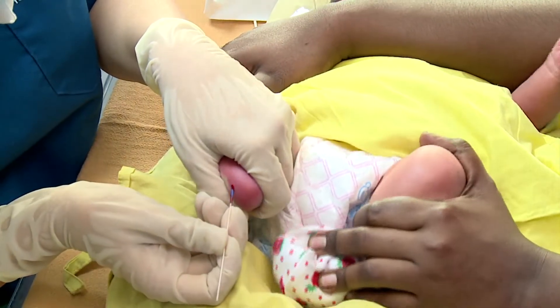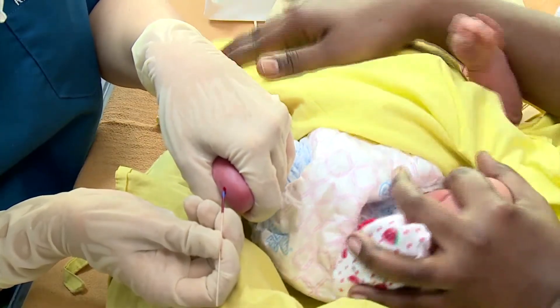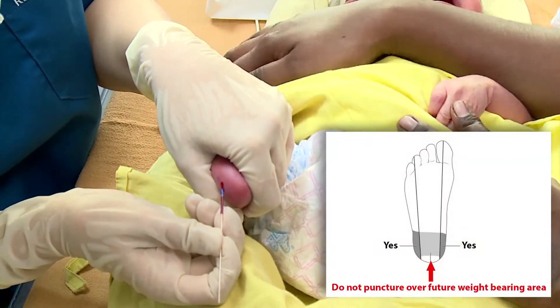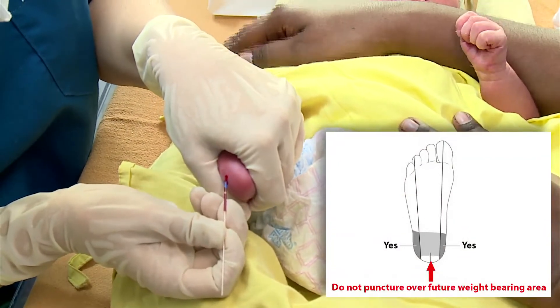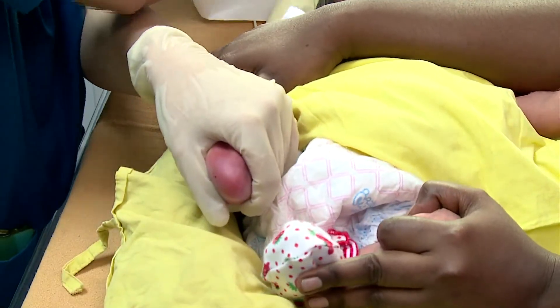Do not puncture through previous sites, which may be infected or cause undue pain to the infant. Do not puncture over the future weight-bearing area of the heel. Blood flow from the site will increase if the puncture site is held downward.